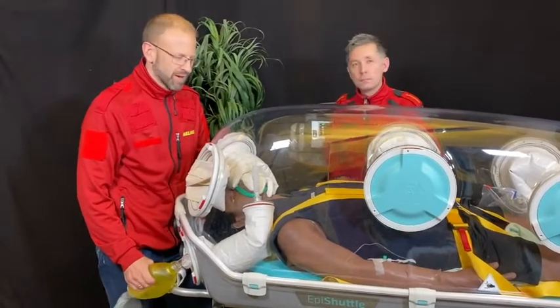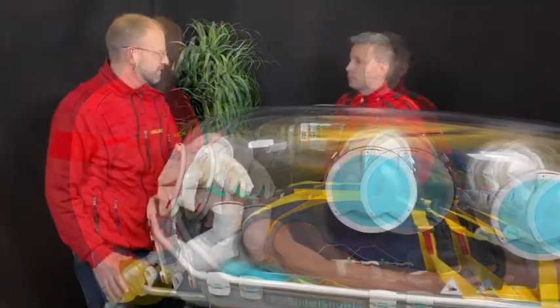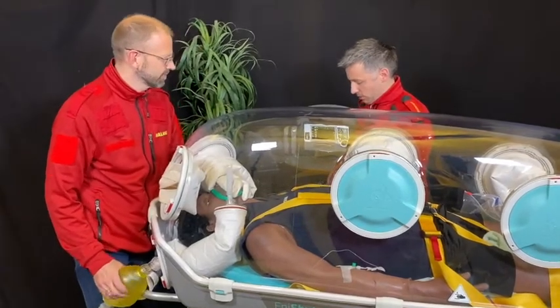We are now going to demonstrate how to intubate a patient in the EpiShuttle. First, 100 micrograms of fentanyl.